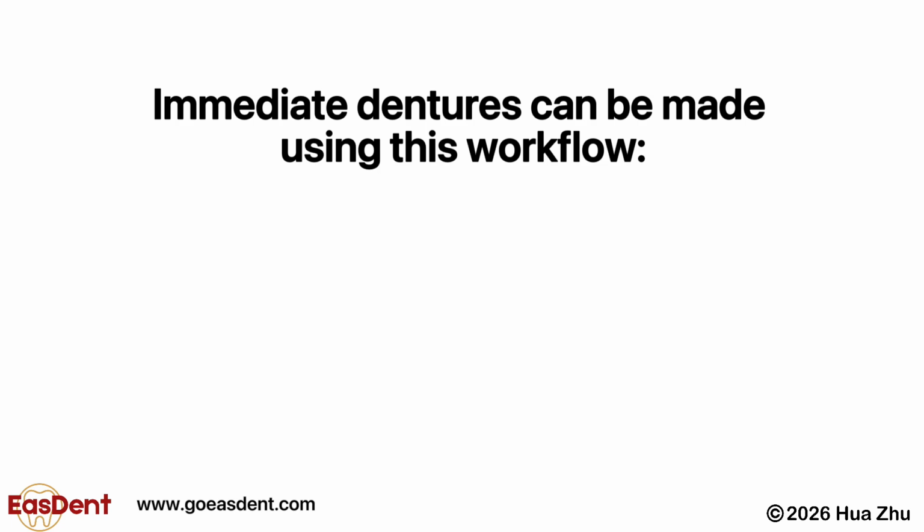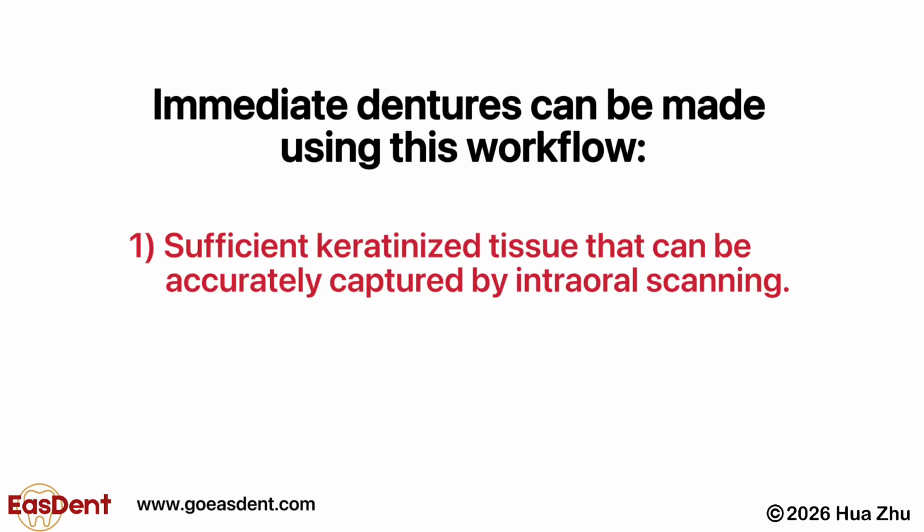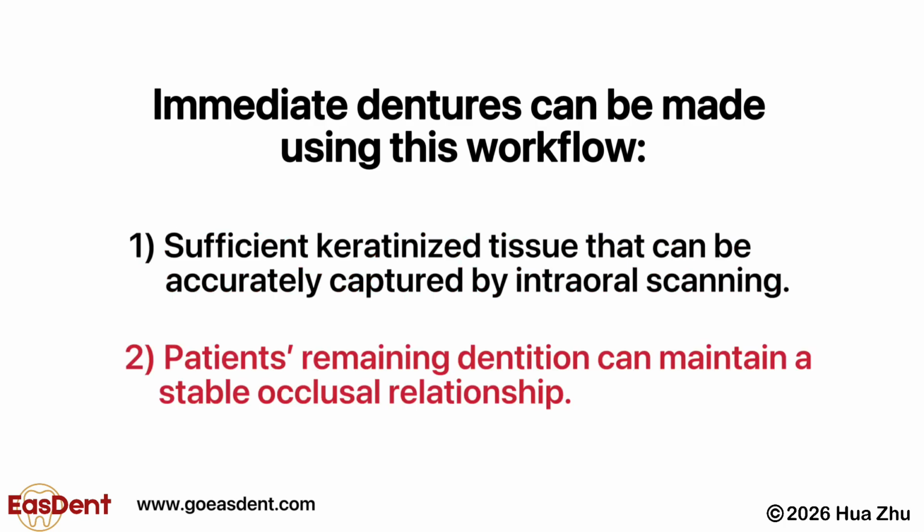Therefore, as long as the patient has adequate keratinized tissue for reliable scanning and sufficient remaining teeth to maintain a stable occlusal relationship, the intraoral scan only workflow can be used for immediate dentures.